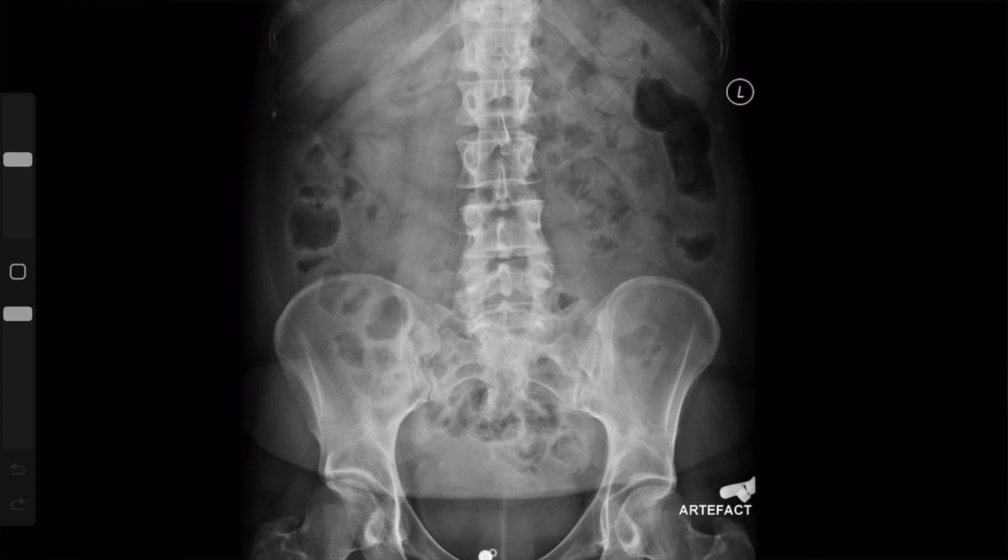This is my approach to the abdominal radiograph. The main question you're trying to answer in this study is: is the bowel gas pattern normal?